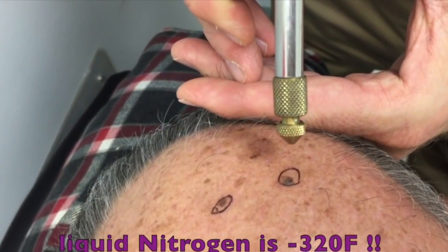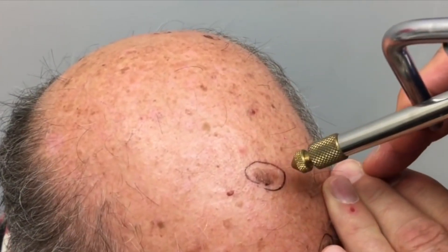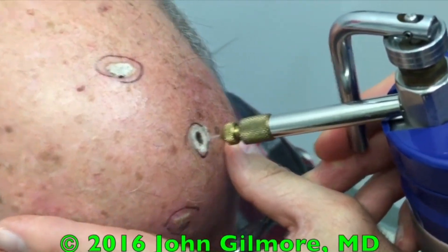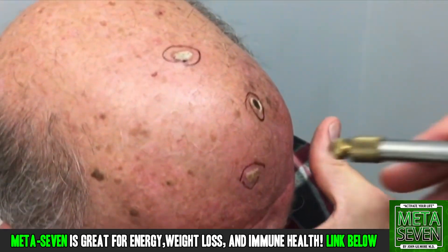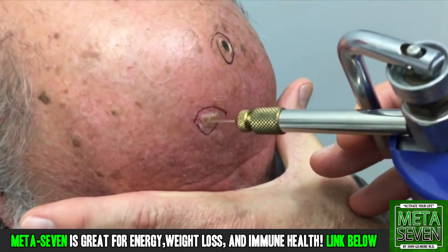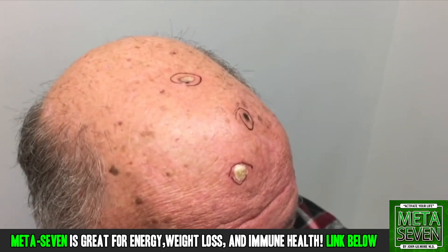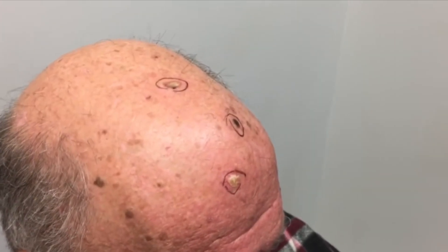It's gonna be cold. This one's a little bit bigger — ready? Now we're gonna wait a few seconds and then we're gonna freeze them all again. We have to go through two complete freeze-thaw cycles. The milk didn't come off and now I don't want to freeze — no, no, it hurts.